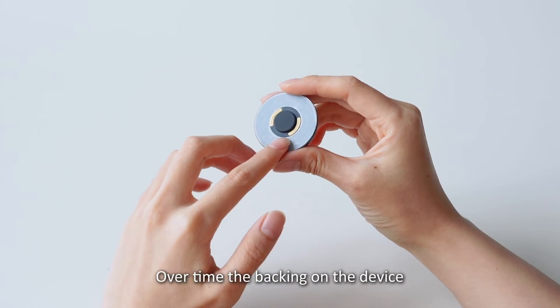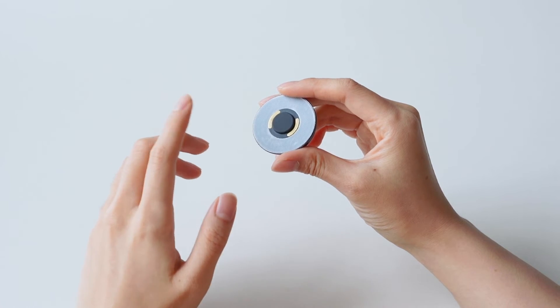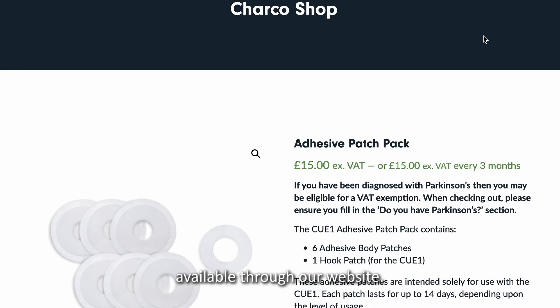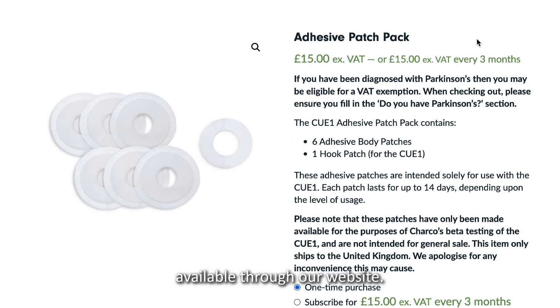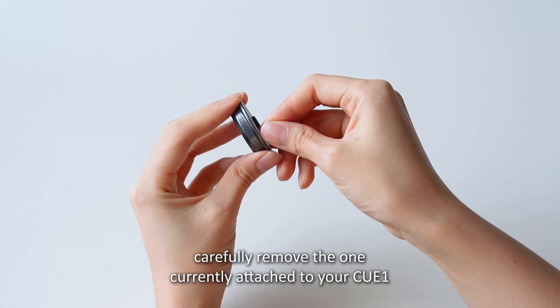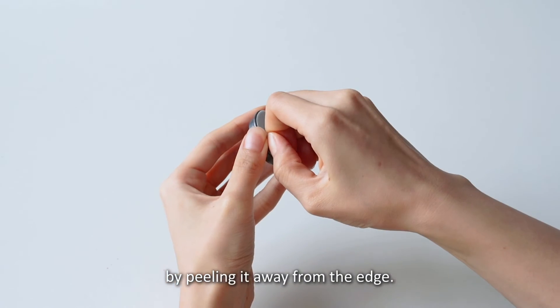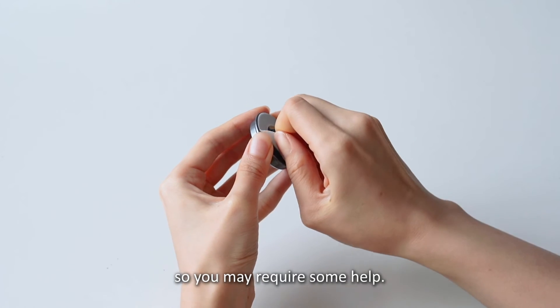Over time the backing on the device may collect dust and become less sticky. One new backing is included in each adhesive patch refill pack available through our website. If you want to replace it, carefully remove the one currently attached to your CUE1 by peeling it away from the edge. It is a strong adhesive so you may require some help.